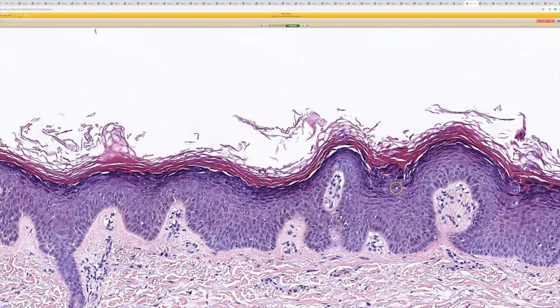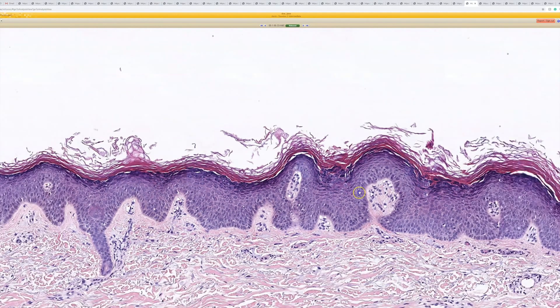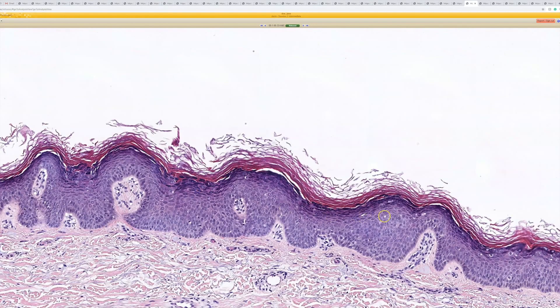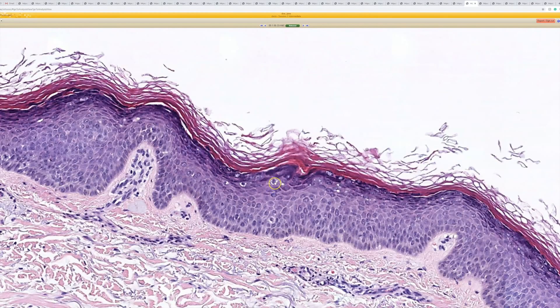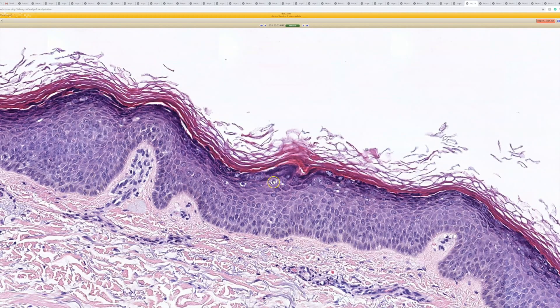Oftentimes you see prominent vacuoles around the superficial nuclei, like here. You don't always see them, but those right there are a key feature.